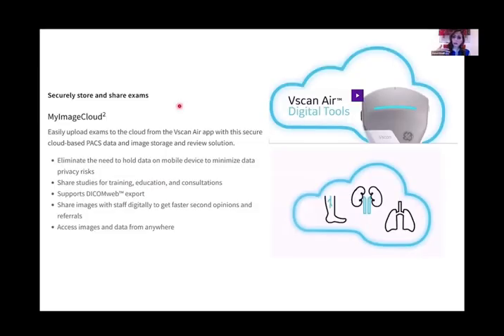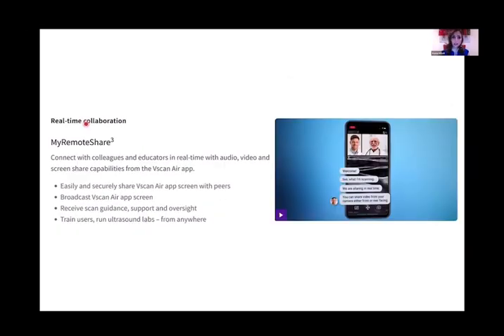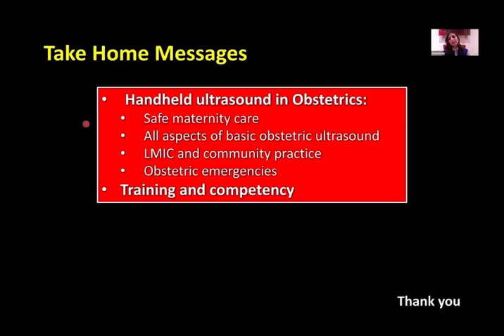And finally, just about the governance, because certainly some of the concern that was highlighted in the Australian Society of Ultrasound document is that the images are not stored, and therefore it doesn't fulfill some of the governance aspects. There are some developments using digital technology, so having the cloud where you can actually store these ultrasound images, and have them accessed, shared and potentially stored. But also having this remote share where you can get maybe a second opinion from a more qualified healthcare professional if you're not sure.